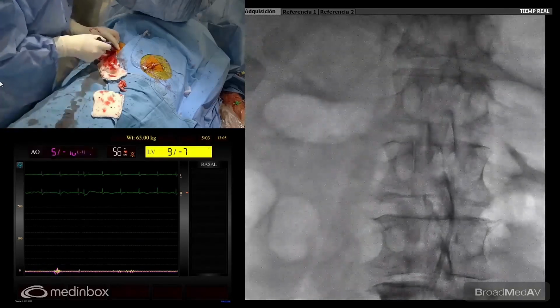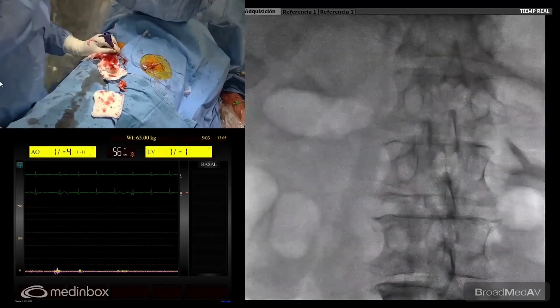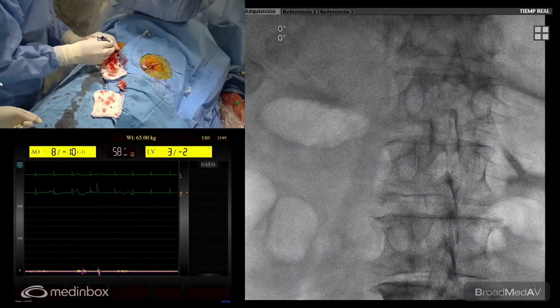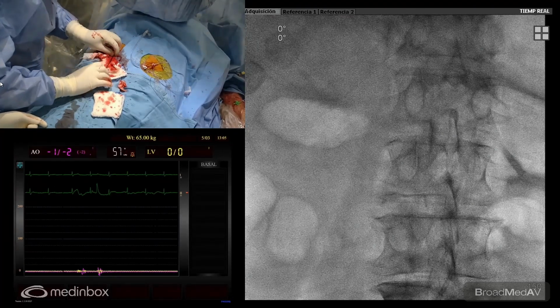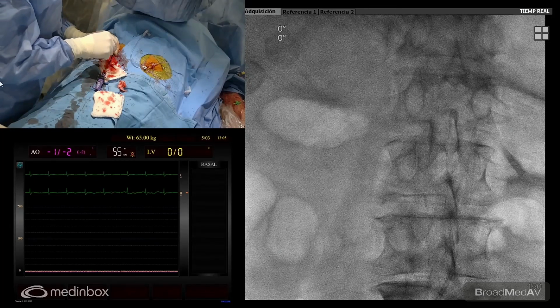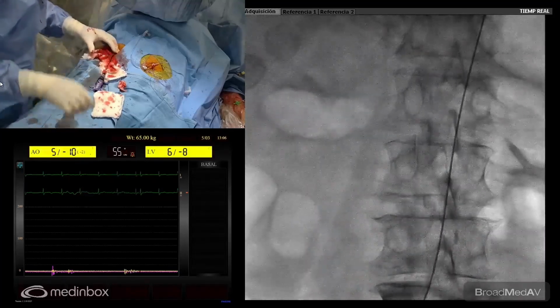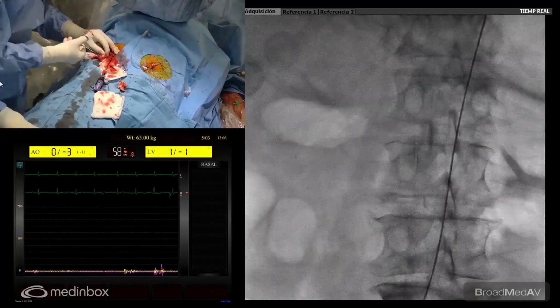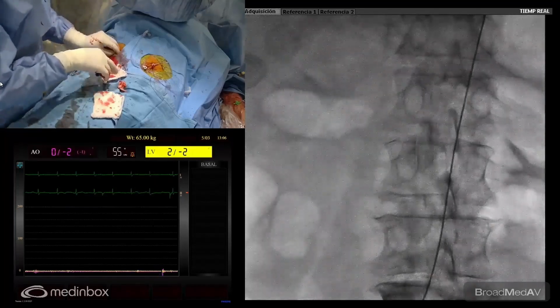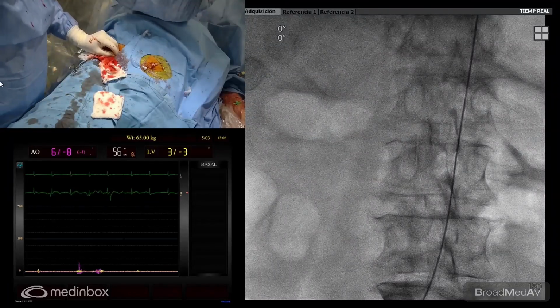We have flow here. Bring me a ProStar. We are going to change. We are also going to use a ProStar. So we will have 6 sutures, because during this maneuver, probably we damaged the artery. Okay, because I have some bleeding, look behind it, outside. So I am going to wait a little bit for the ProStar. It's gonna be okay.